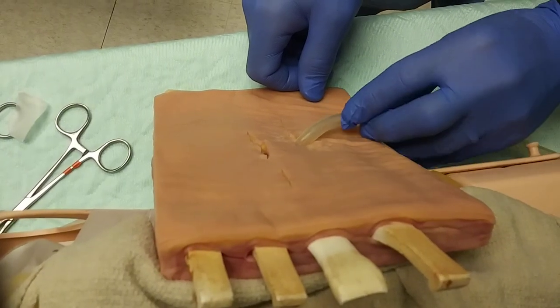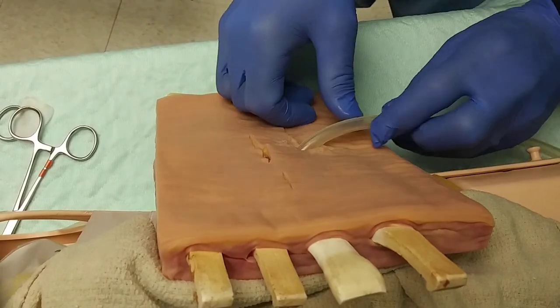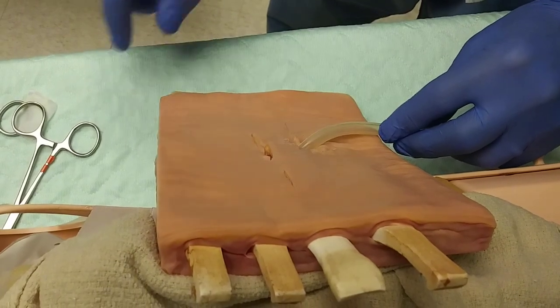Here to discuss the alternative method of using towel clamps to secure a chest tube temporarily in the resource-poor setting of the pre-hospital critical care transport setting.